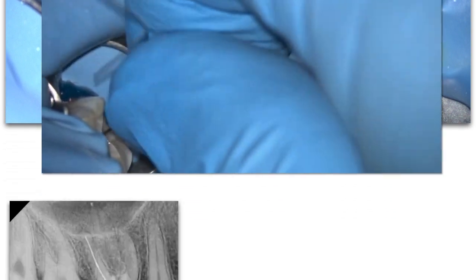So let me show you something which is also in my clinic. Here I have a case. They referred it to me because they had a file separation inside. After I took a picture, I knew that there was more than one piece inside the tooth, and they had many problems in this case, really. So they sent it to me to solve the problem.